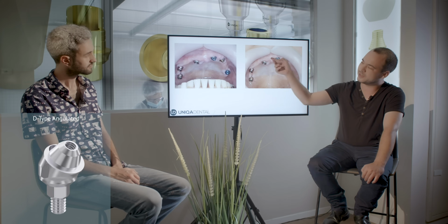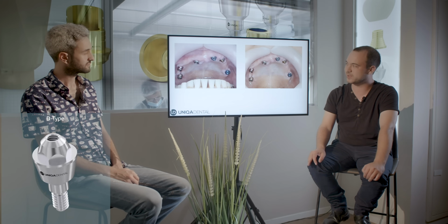Here you can see, after adding some implants, how it looks. You have about 6 implants. You can see those 3 are angulated, and those 3 are healing caps on straight multi-units. This is what we used here. So all in all 6 implants, 3 angulated, 3 parallel on straight multi-units.